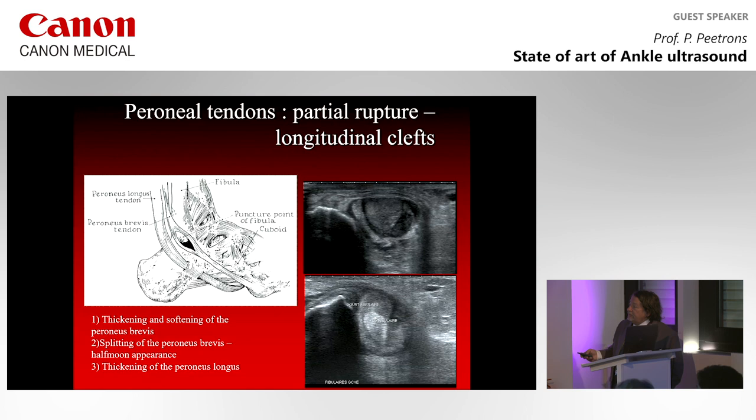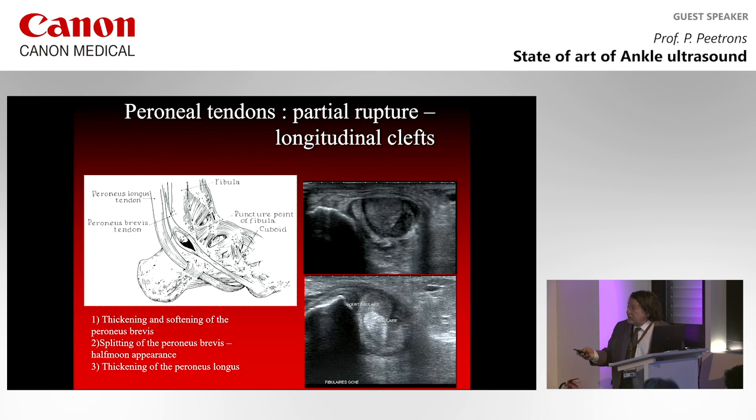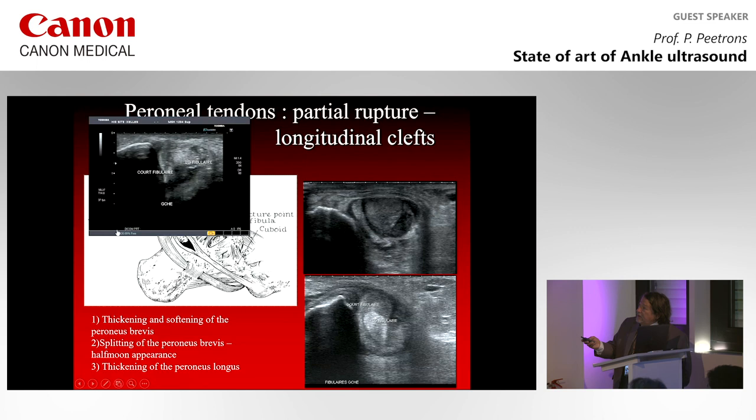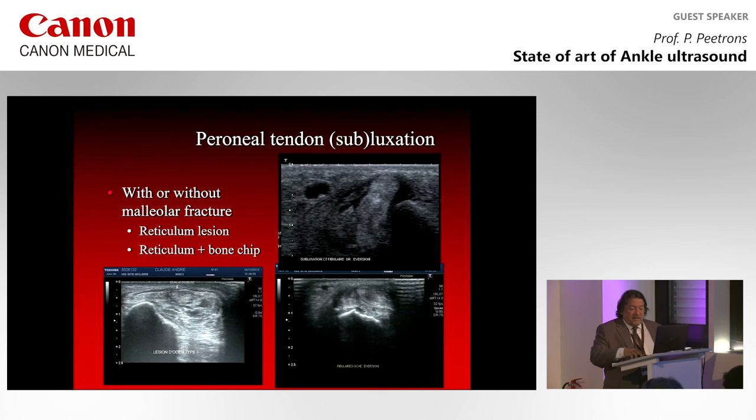In this example, you can see that the peroneus brevis is turning around the peroneus longus. This is what you can see when the peroneus brevis is about to be torn with a longitudinal cleft. So don't forget this boomerang image, or the circular image of the peroneus brevis around the peroneus longus, which is abnormal in every case. This is an example that you can see in this short video. The peroneus longus is on the top, the peroneus brevis is here, and you can see that the peroneus longus is going inside, and then after, you see the cleft inside, just in the submalleolar space, inside the peroneus brevis. So the cleft is about to come when you see these lesions of the peroneus brevis.